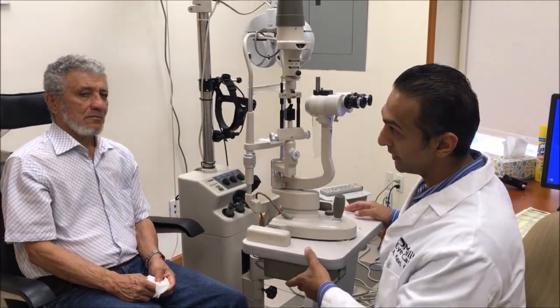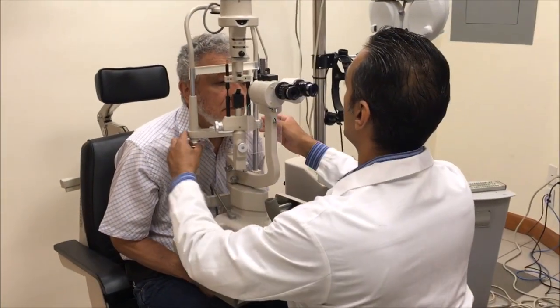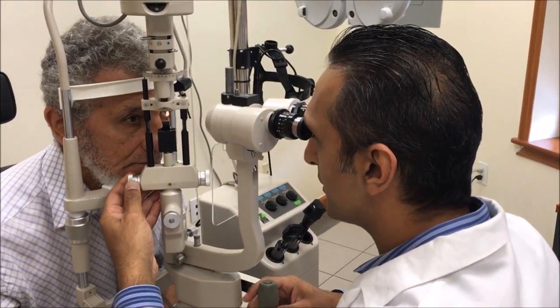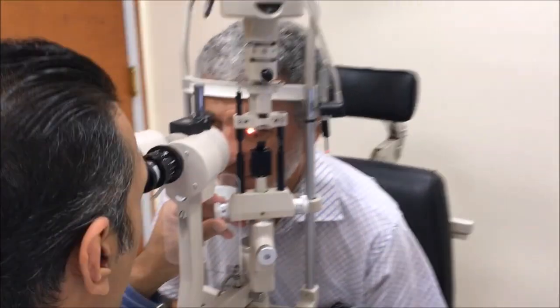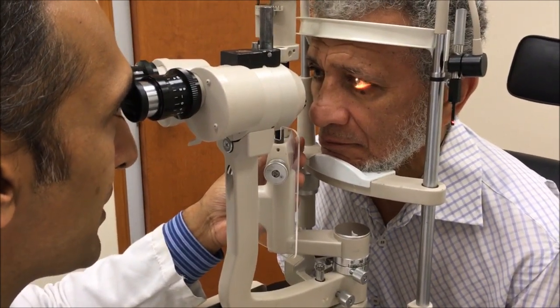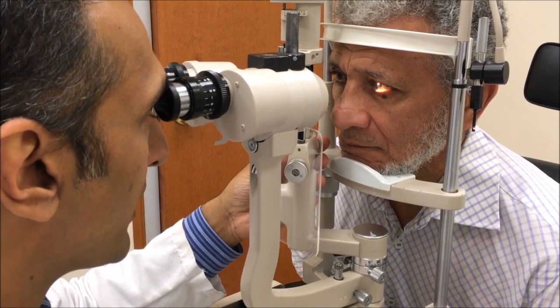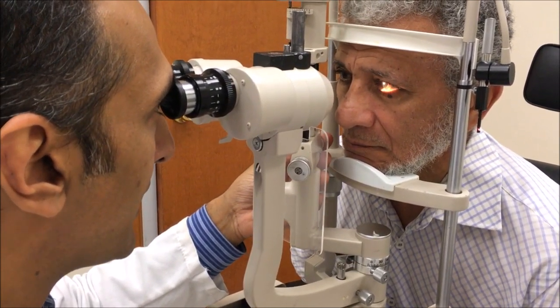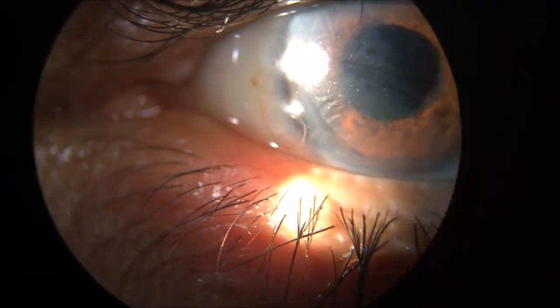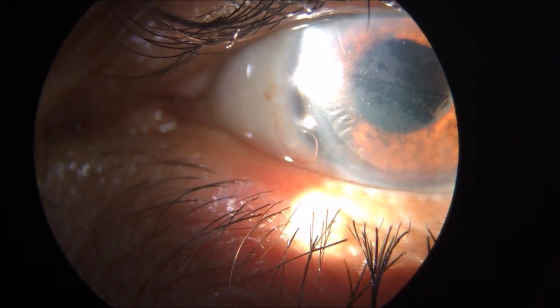Okay, so here we are about four minutes later and he's comfortable — it's really a very well tolerated product. On a large scale it seems like there are really few to no wrinkles, though certainly through the microscope you can see there are a few wrinkles, but you expect that. It's really quite well centered, and aside from one small air bubble between the contact lens and the peripheral part of the cornea around seven or eight o'clock — which is going to clear as the next couple of hours go on — he looks really, really good.